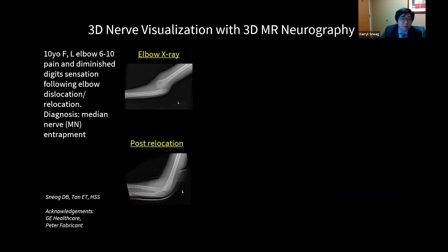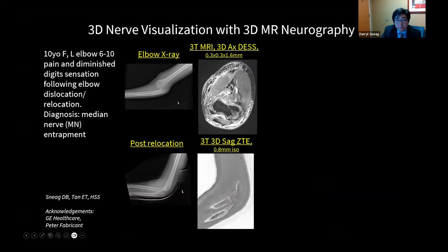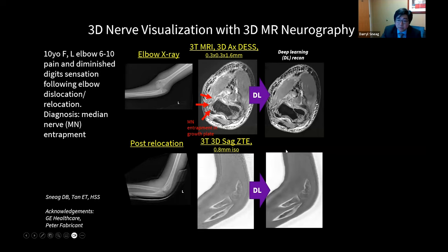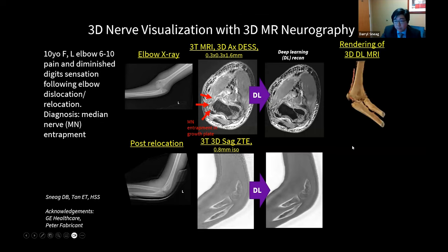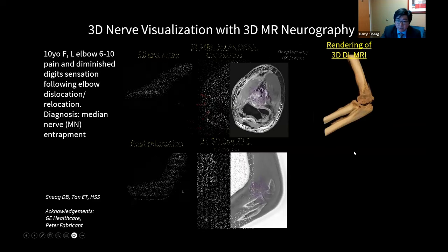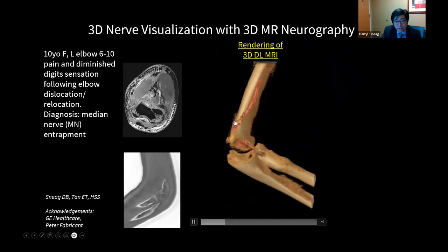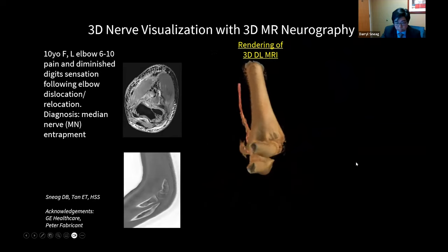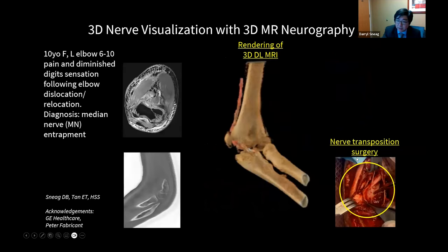An elbow example: a 10-year-old female with a fractured and relocated elbow. The median nerve was entrapped during the fall or relocation process. Using 3D MRN, we see the median nerve is entrapped in the growth plate, which we can compare against the 3D ZTE bone image. We also apply Deep Learning Reconstruction to reduce noise and sharpen images before 3D rendering, revealing the trapped median nerve at the growth plate — corroborated by intraoperative photographs from nerve transposition surgery.